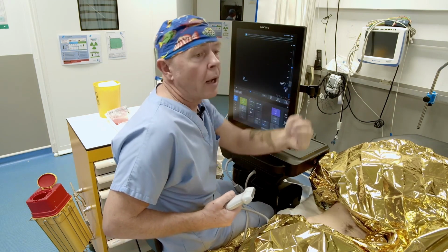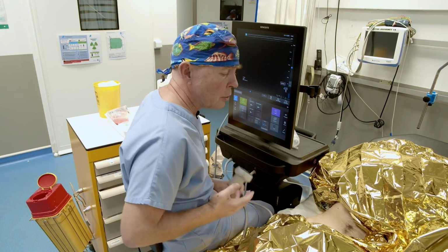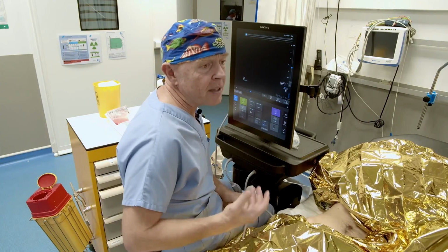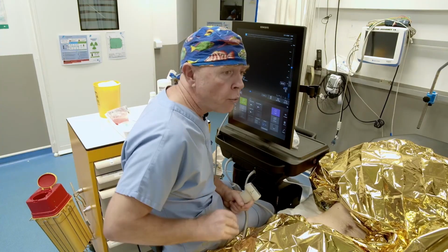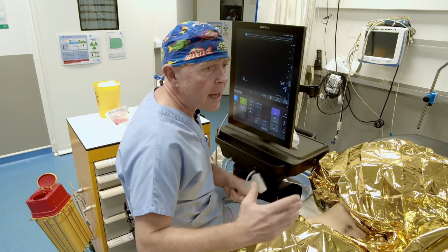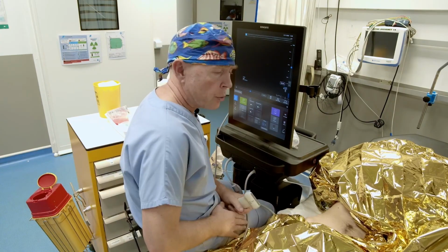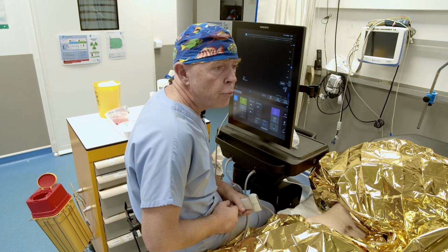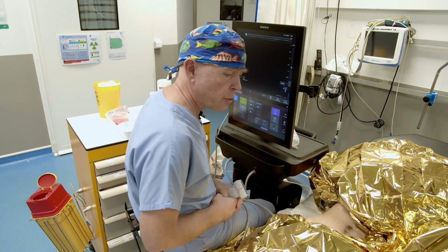A little bit lower down. So we're going to position ourselves. Actually, I position myself as if I were doing an epidural. I do it with the patient sitting because I am more comfortable, but you can absolutely do them with the patient lying on their side in the lateral decubitus position. Personally, I'm more comfortable with the patient sitting. Generally, I do them on an awake patient to go faster. And above all, to have a better view of my needle and the area where I'm going to operate. So let's get set up. And then we'll show you this last block.